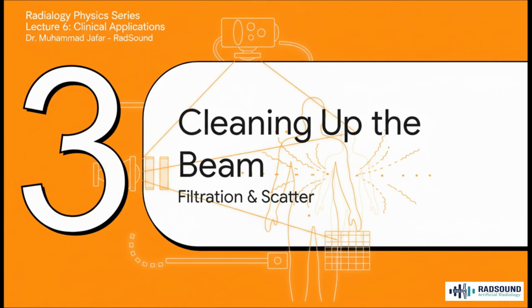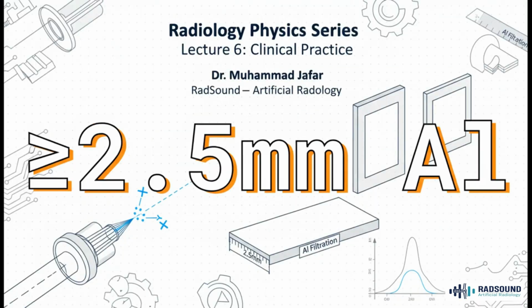But the beam coming out of the tube isn't perfectly clean, and once it hits the patient, it creates a total mess of scattered radiation. So our next job is to clean all that up. Here's another number for you. This one's an absolute, non-negotiable regulatory requirement.